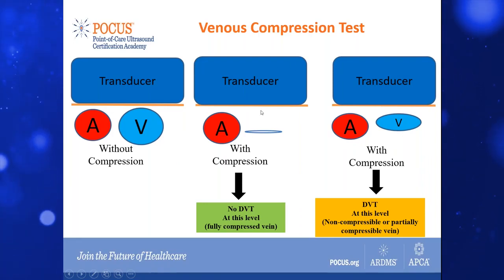We simply compress down in the transverse view, and we have to obliterate the vessel — we call it coaptation — and the vessel should completely collapse.